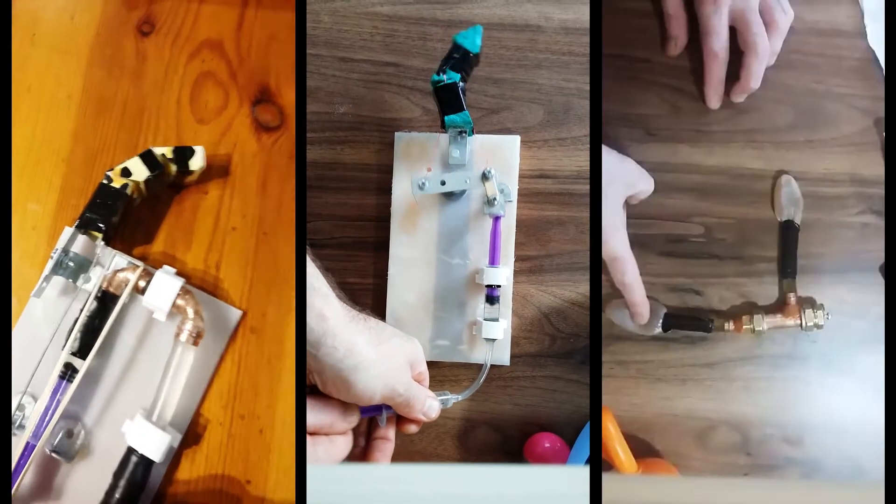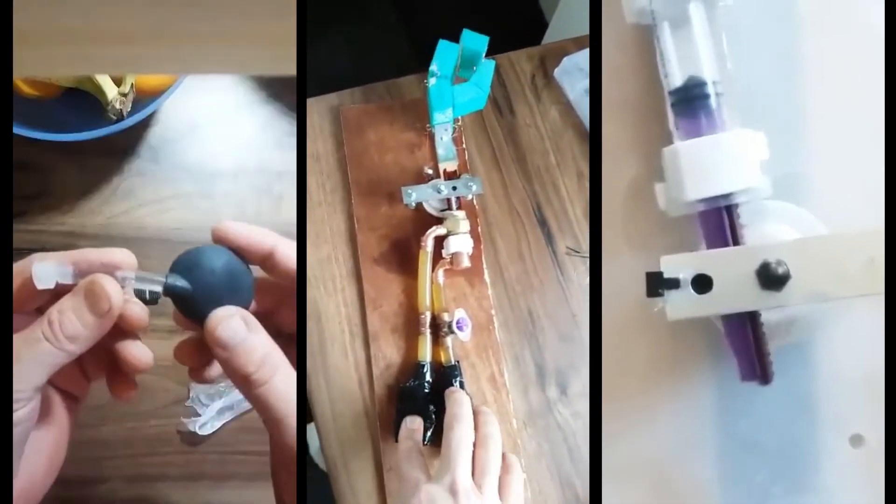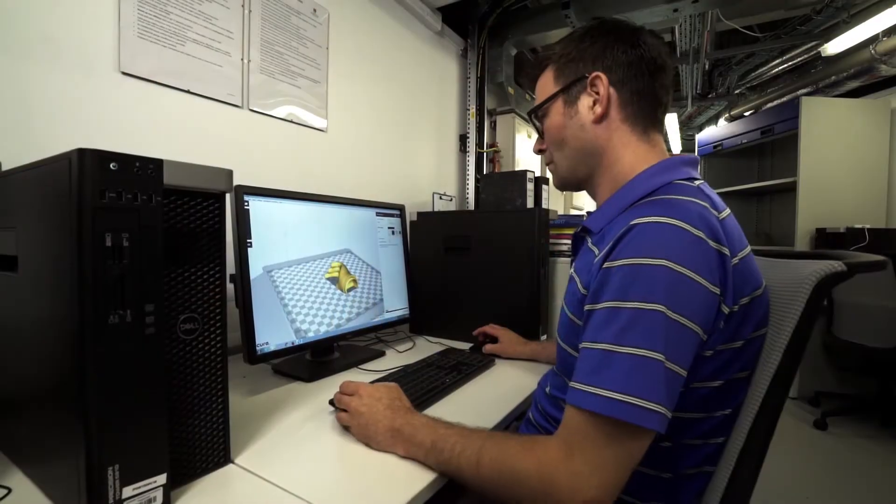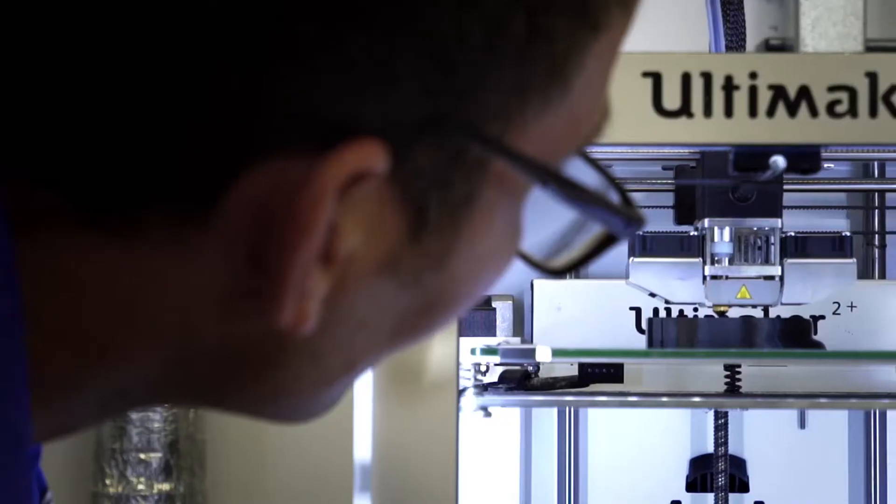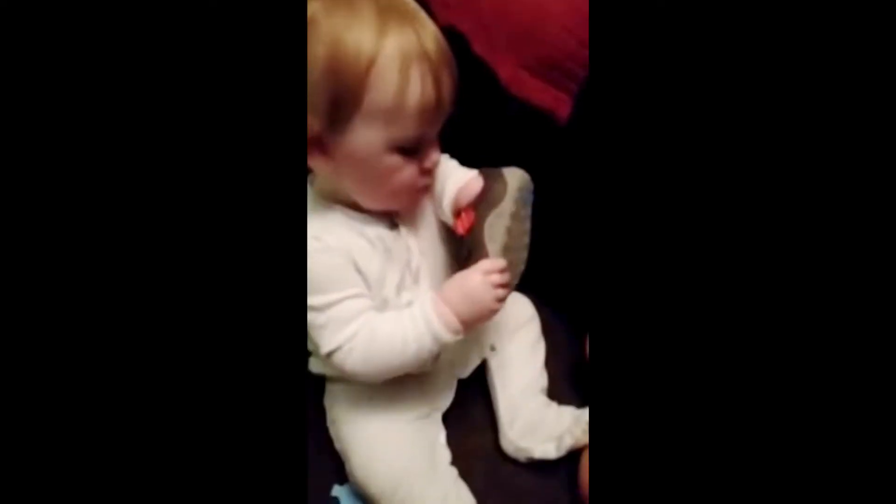I started making prototypes with off-the-shelf components, washers and screwdriver handles, gluing bits of plastic and tubes together. Then I realized actually the cheapest way of doing all of this is 3D printing. I came to Bangor University to see if I could get some help.